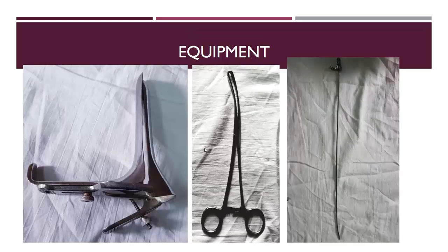These are the equipments used. We have here a Cusco speculum, and we have a multiple toothed vulsellum, and we have a sound. And this sound is very important. When you find resistance, sometimes there is tightness at the level of the internal os, so you have to introduce the sound in order to pass this tightness.